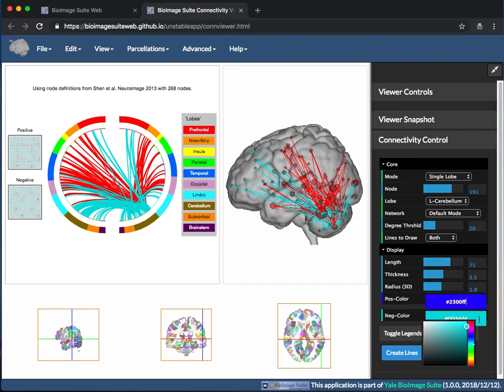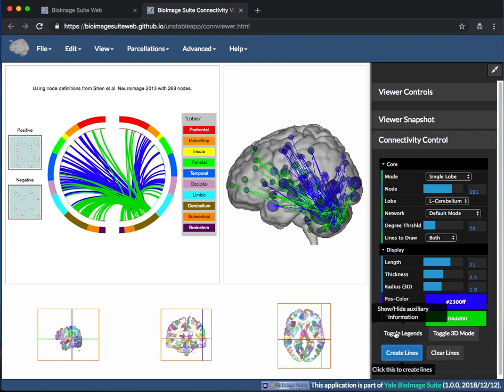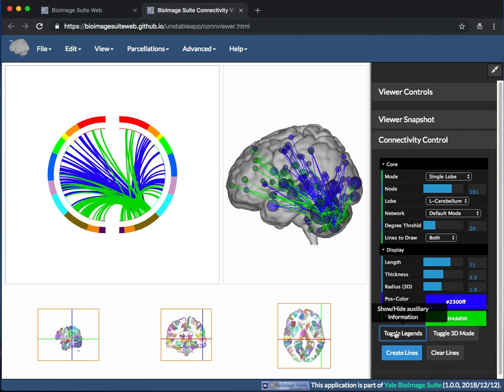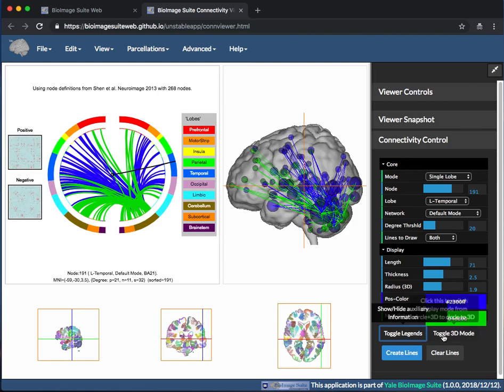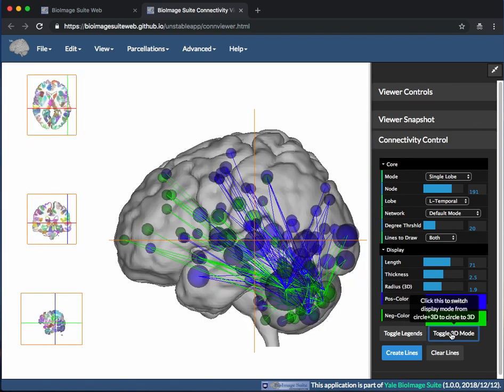The toggle Legends turns on and off the legends of the image, and toggles the 3D node mode between 2D, 3D, and both views.